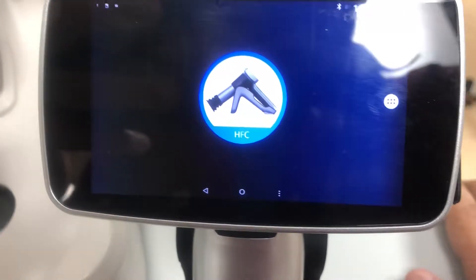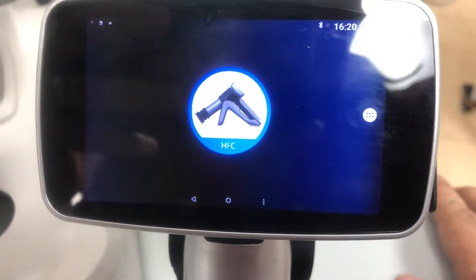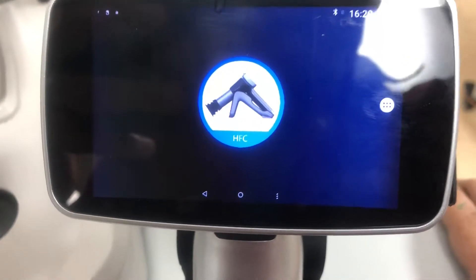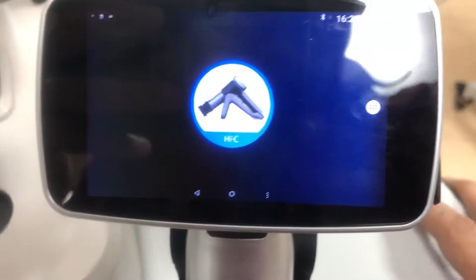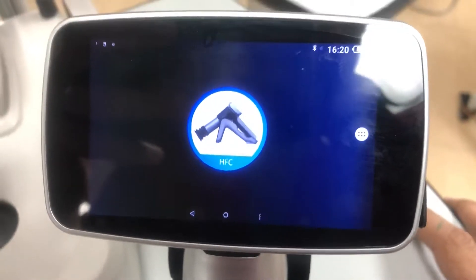This is going to be a quick guide of how to use the Luna Portable Fundus camera.